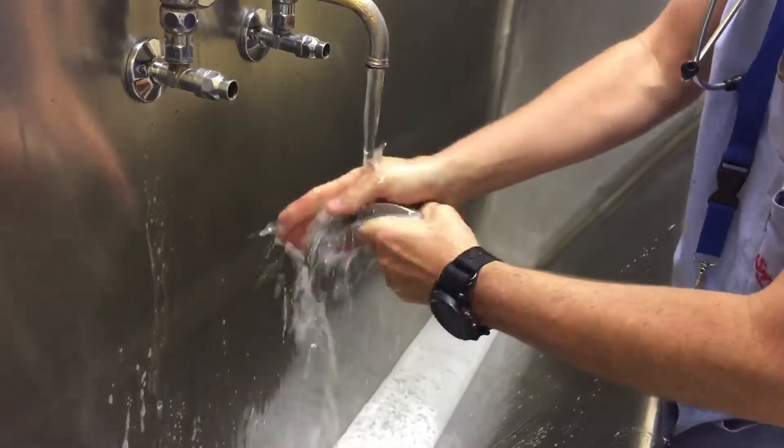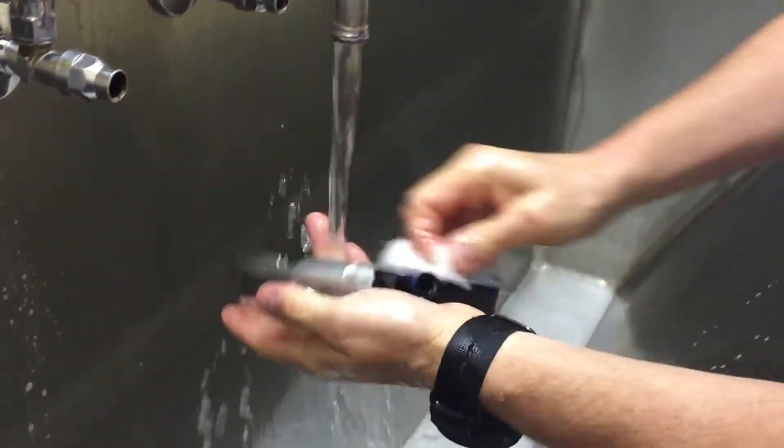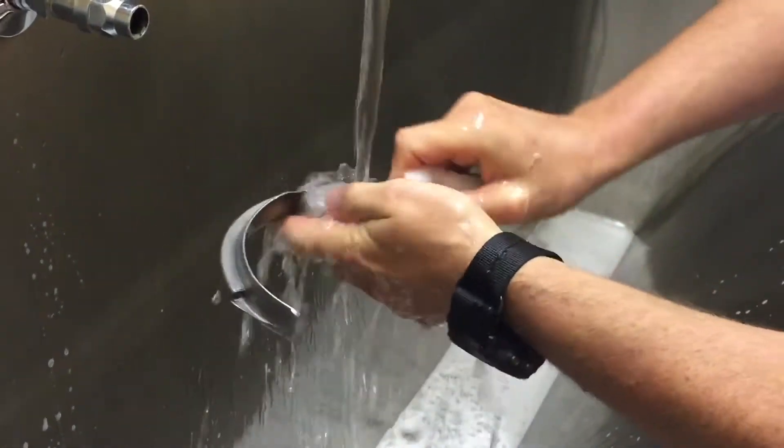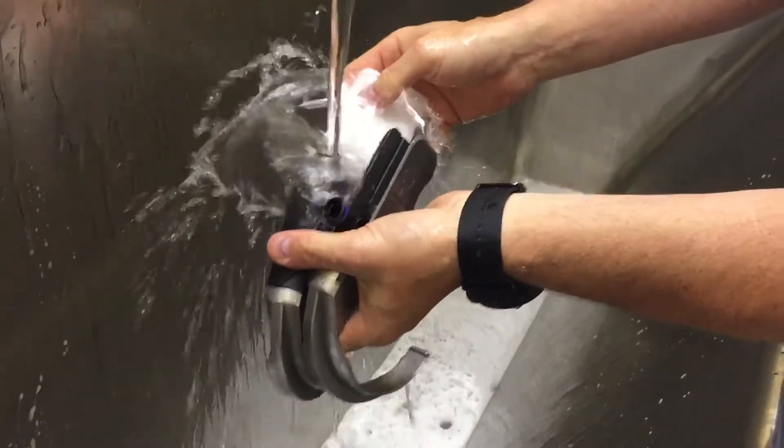If you'll notice, when the protective cap is on it's submersible, it's safe, it can go in the water. The grey blades need the protective cap. The newer black-handled blades don't need a cap — you can get water right in there.